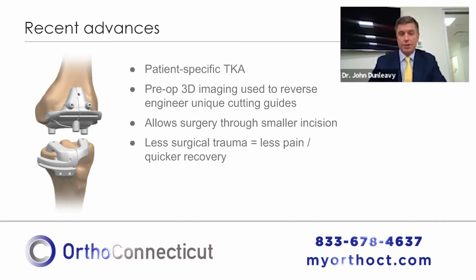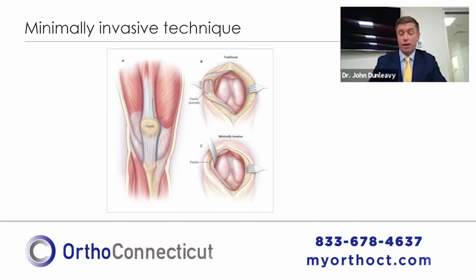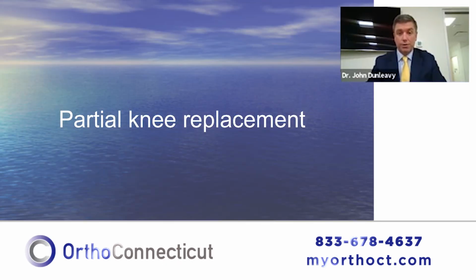There have been some advances. There's what's called patient-specific knee replacement, where the patient will get an MRI beforehand, and these cutting guides that are depicted in the cartoon are made for their unique anatomy to help us during the surgery. And that allows the surgery to be done through a smaller incision with less trauma and hopefully then less pain and a quicker recovery. And also the minimally invasive technique depicted here that avoids cutting into the tendon above the kneecap. That's also something that can speed up the recovery. And this is, at this point, something I do on just about every single knee replacement.